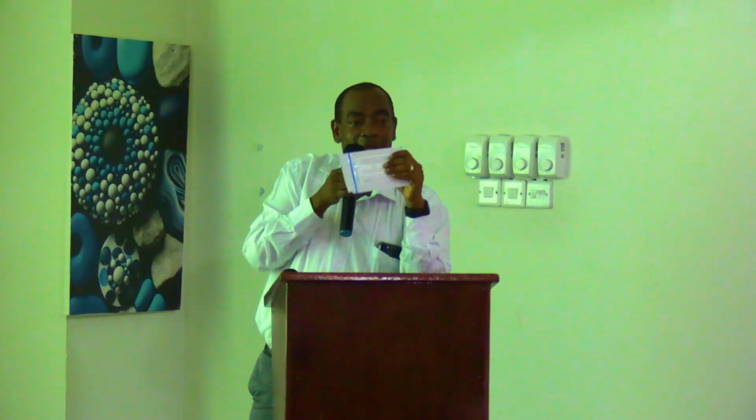The work of this system check is to check on the optics and the electronic calibration integrity of our equipment. So if the calibration is not okay, then it will be detected by this, the hardware. The manufacturers tell us there are two optics. So if any of these is not functioning well, then it will be detected by this.